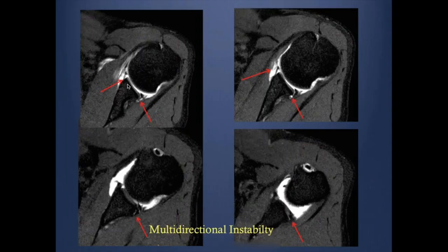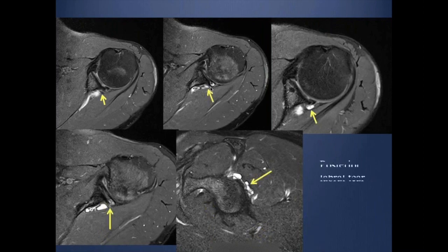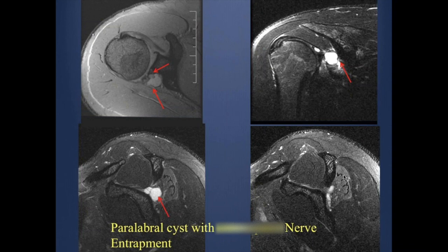A labral tear can present with an associated paralabral cyst. If a cystic area is seen adjacent to the labrum, this indicates a labral tear with paralabral cyst. When a cyst is identified, careful evaluation for nerve impingement is required. In one example, a paralabral cyst in the spinoglenoid fossa is associated with abnormal signal within the infraspinatus muscle compared to the supraspinatus, consistent with denervation edema from suprascapular nerve entrapment.